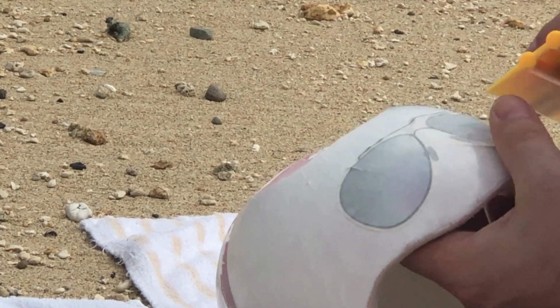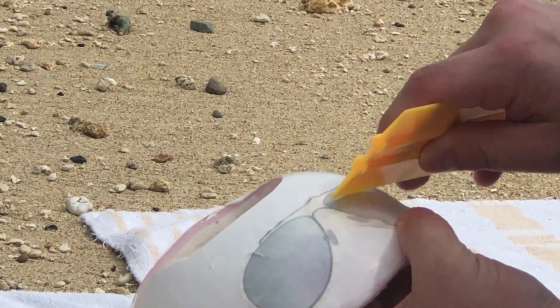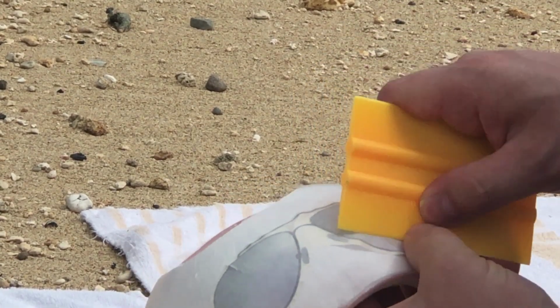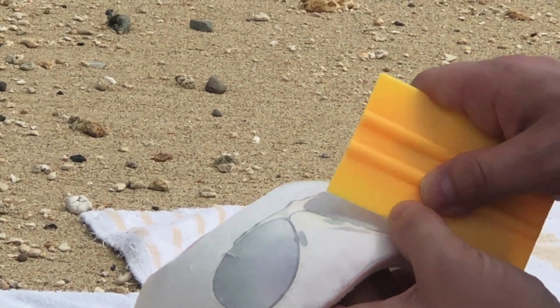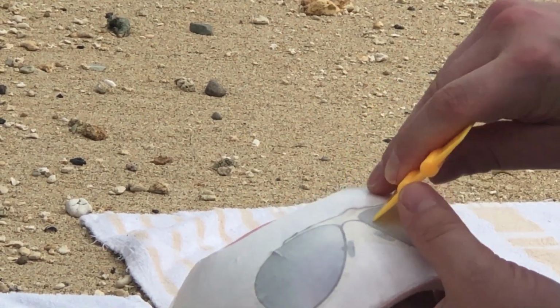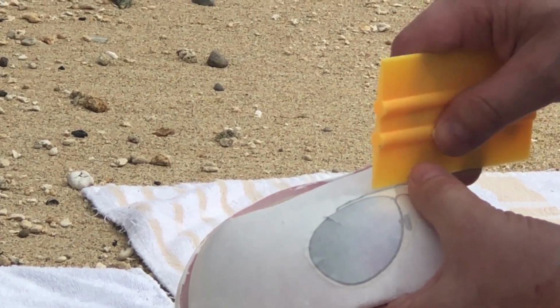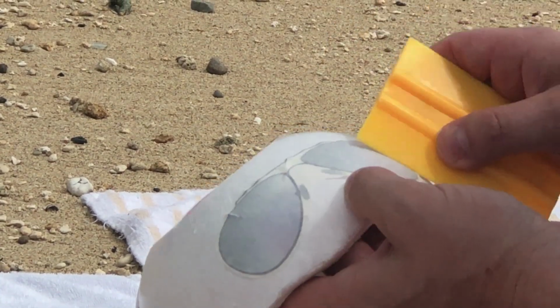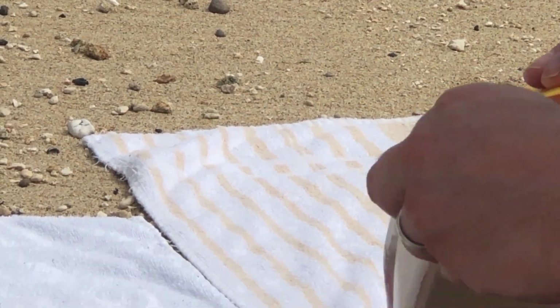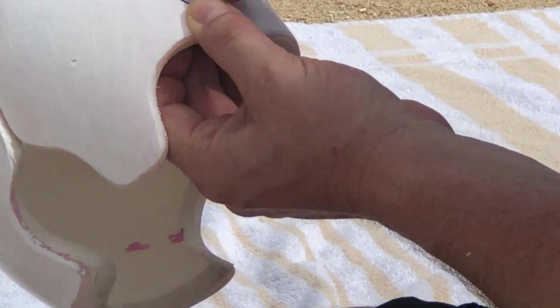As I work towards the edge of the glasses, anything that looks like a crease needs pushed down a little at a time. I'm not trying to get rid of each crease and then move to the next one. I'm just pushing a little on this one, moving around to the next one, moving around to the next one. I want to get them all down at about the same time. I don't mind if the transfer tape develops a crease, I just don't want to see a crease in the vinyl.